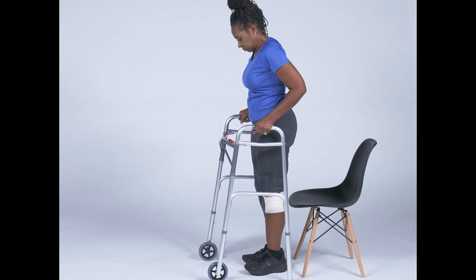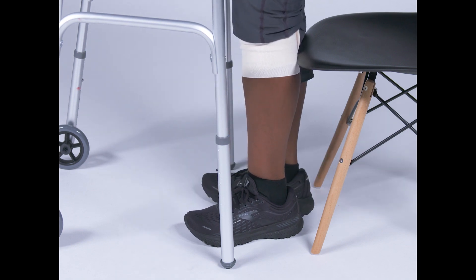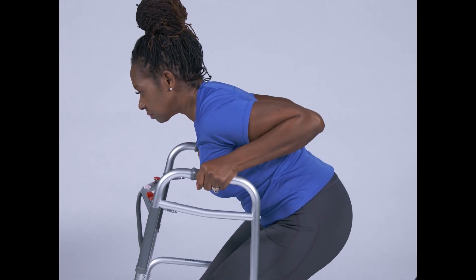To sit down in the chair, a similar approach should be used. Make your way to the front of the chair. Do not hold on to the walker with both hands and attempt to sit down, as this may cause you to fall into the chair or miss the chair completely.